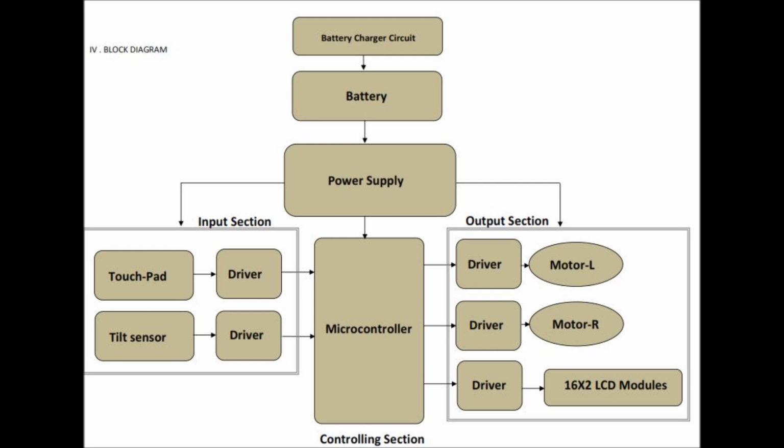Coming to the programming aspect of the microcontroller, we prepared embedded code to collect input variations and to control output jobs. We have mainly used 4 channels of ADC to take variation from the touchscreen and I/O to receive head sensor signals wirelessly. In order to control the motors, the pulse width modulation technique is applied to the IR2101 H-bridges with 20 kHz waveform generation.